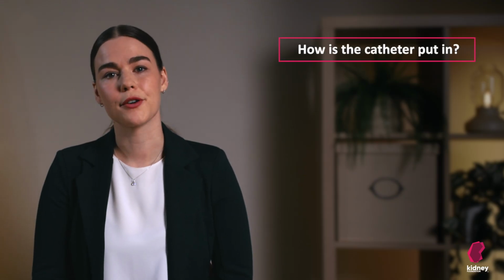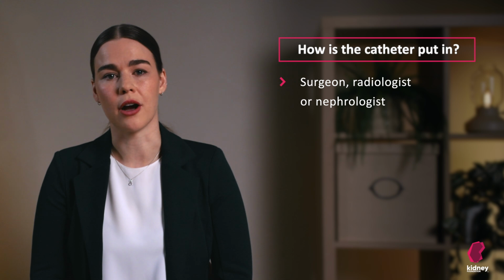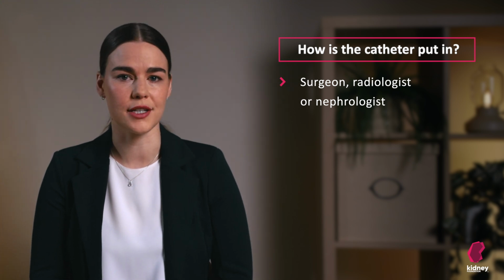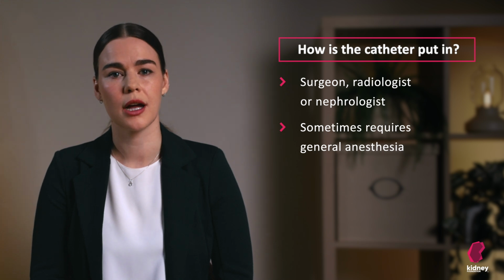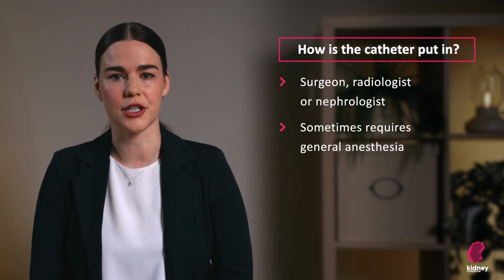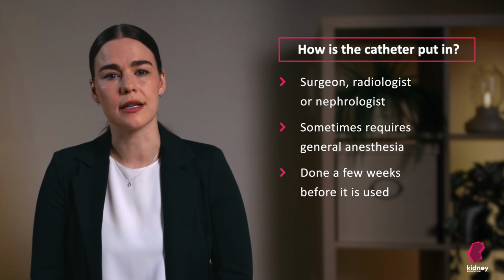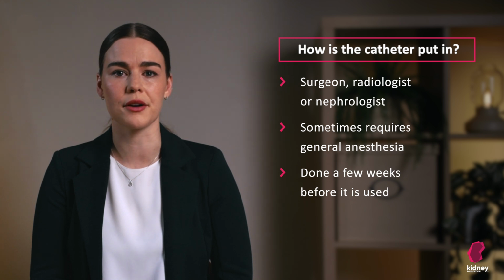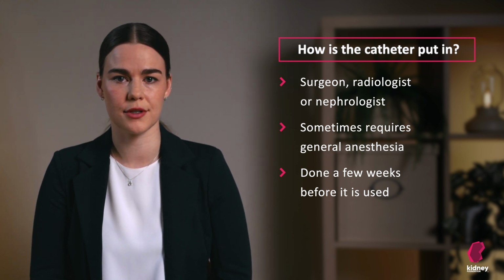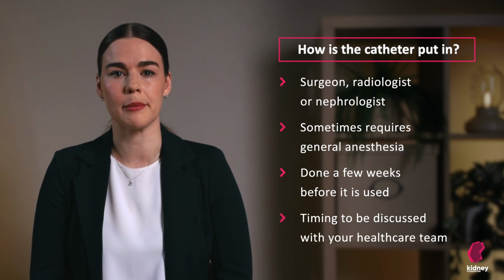Now, how is the catheter put in? Catheters are placed either by a surgeon, a radiologist, or sometimes a nephrologist. You may need to be put to sleep for the procedure, meaning being under general anesthesia. Your catheter should be inserted a few weeks before you start dialysis, so the skin and tissue around the catheter can heal before it is used. Your healthcare team will discuss with you the best time to have your catheter inserted.